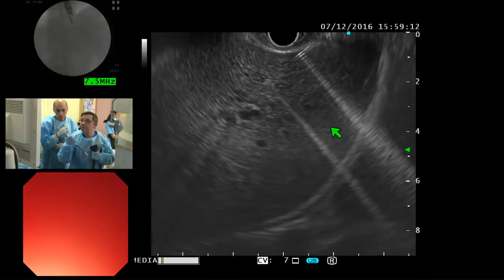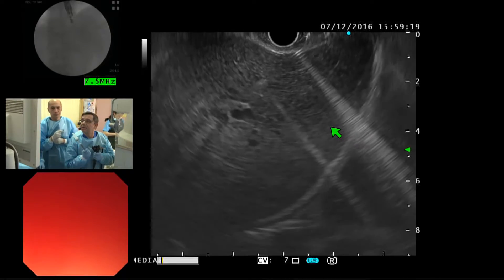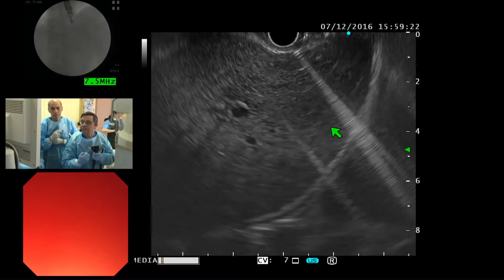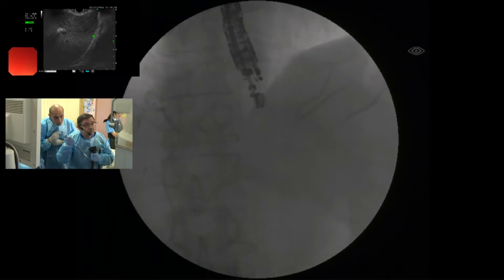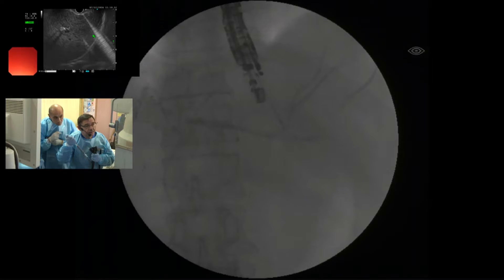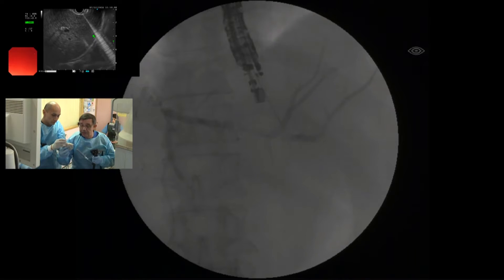All the movement — respiratory movement — we can lose position. Again — yes, again. I try to put more contrast. Give me the wire, please. I need the patient still; they are sleeping well. Okay, this is not bad — I'm in the bile duct, but the direction is not ideal. Yeah, very good.